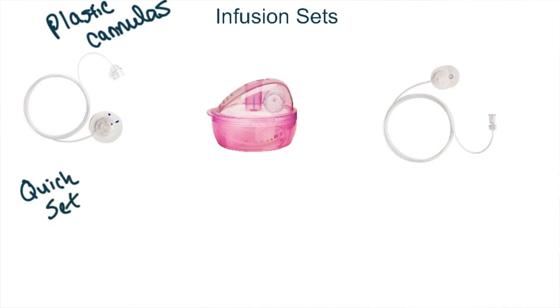That one you put in manually. I think it does have an injector, but it gives you the option to just put it in yourself, which I always did and still do. It just makes me feel more comfortable for whatever reason. I don't like that pow of the injector. It creeps me out.